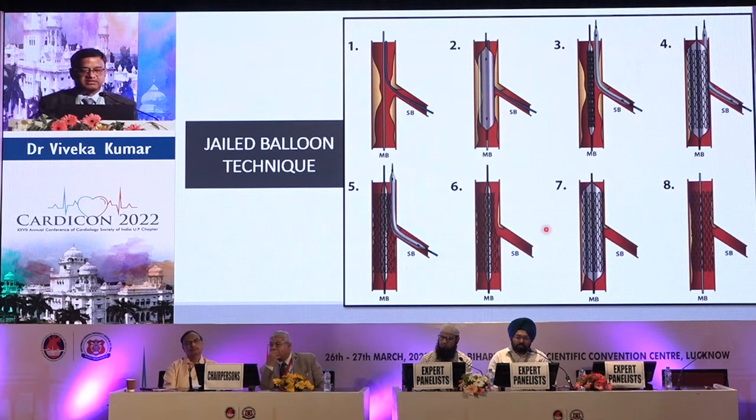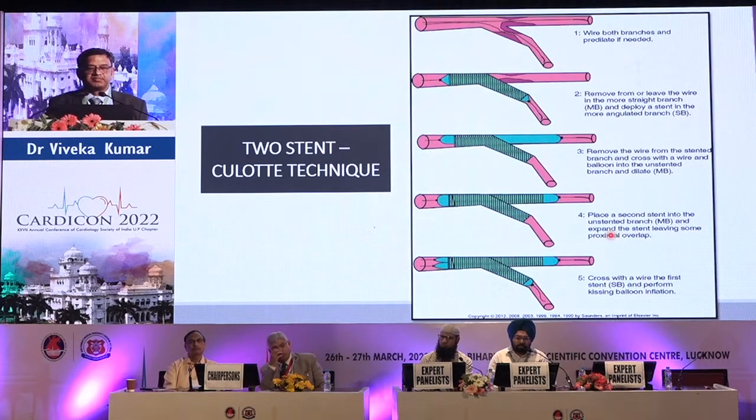In Oriental countries, there is a new technology gaining momentum, the jailed balloon technique. In this technique, the uninflated balloon is kept in the side branch and you stent it, and the chances of occlusion of the side branch, even if the plaque is there, are significantly lesser, but it's not very commonly practiced by purists.